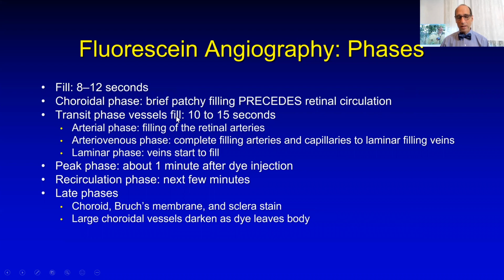And then you get a transit phase in the fill, which is 10 to 15 seconds. This includes your arterial phase, where only the arteries are full. Your photographer has to be really quick to get the arterial phase. This is only a second or two, a couple of seconds.